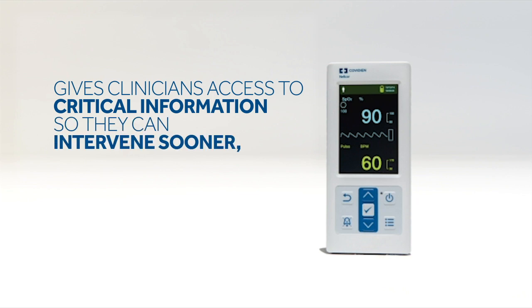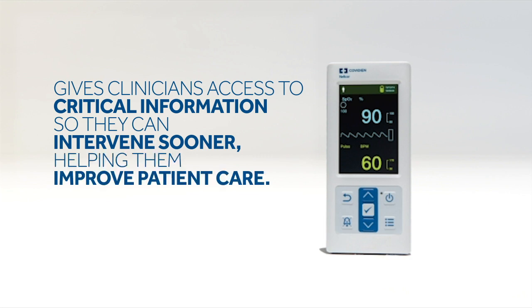Its lightweight design and simple features make it intuitive to use and easy to operate. With its highly accurate readings, the PM10N is an excellent tool for a variety of tests such as the six-minute walk test, CCHD screening in newborns, and the car seat challenge.